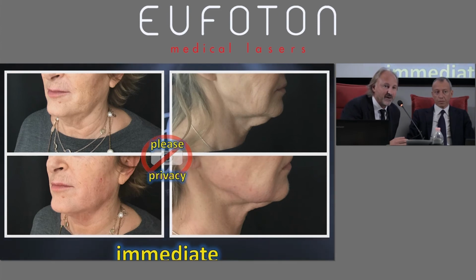Above all, if it's a minor local anesthesia, we do this just for the patient. The method can also be good without anesthesia. Endolift originates without anesthesia, but anesthesia is also possible when the specific conditions of that patient require it.